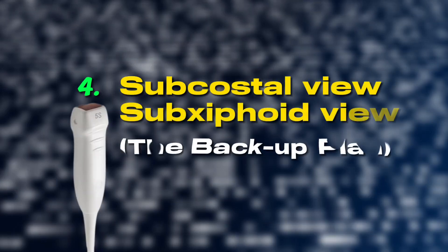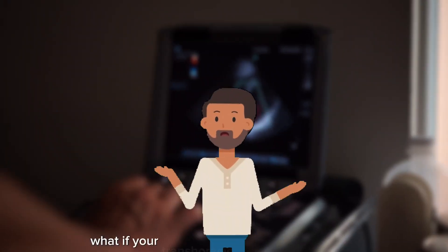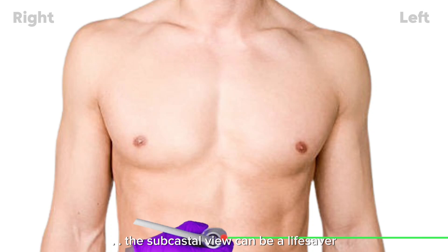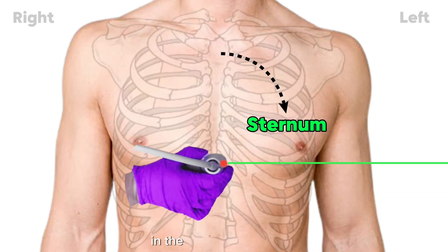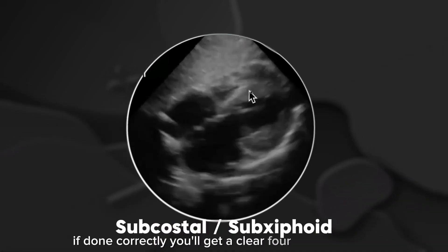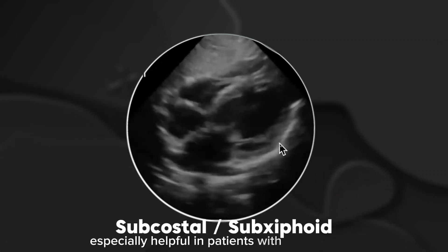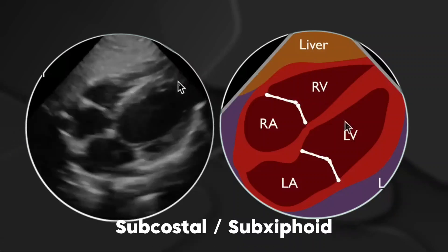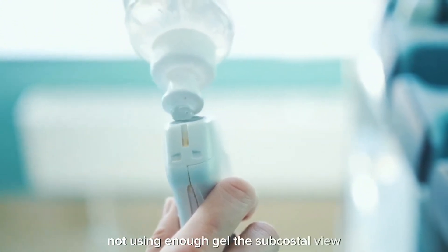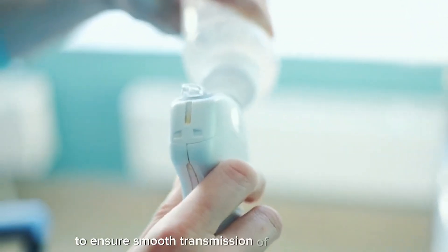Subcostal view — the backup plan. What if your transthoracic windows aren't great? No problem — the subcostal view can be a lifesaver. Place the probe just below the sternum in the sub-xiphoid region. The marker should be pointing left at 3 o'clock. Now angle the probe superiorly, pointing towards the heart. If done correctly, you'll get a clear four-chamber view, which is especially helpful in patients with lung disease or poor acoustic windows. Common mistake: not using enough gel. The subcostal view needs a lot of gel to ensure smooth transmission of ultrasound waves.